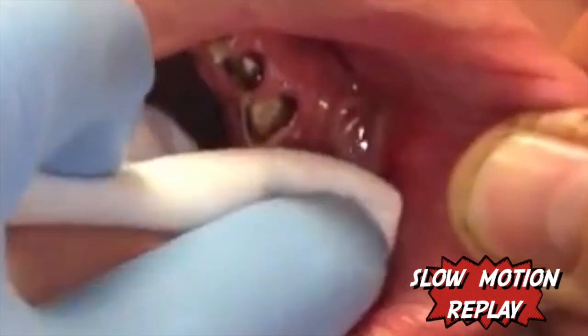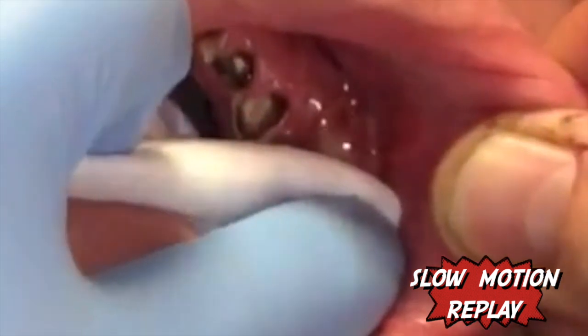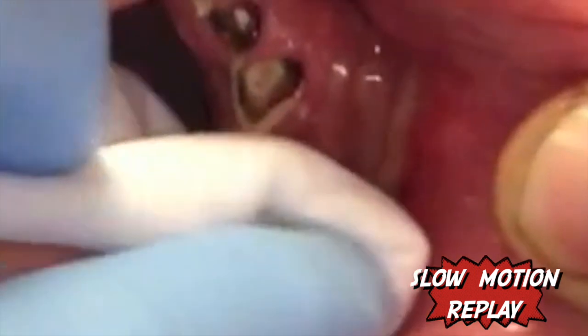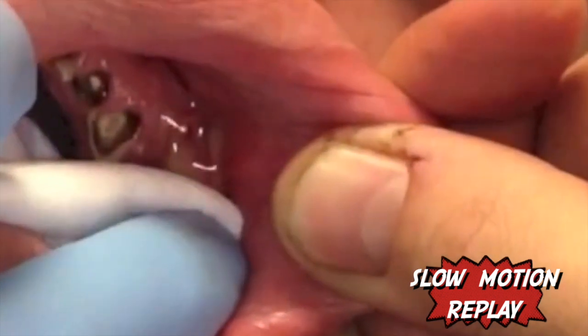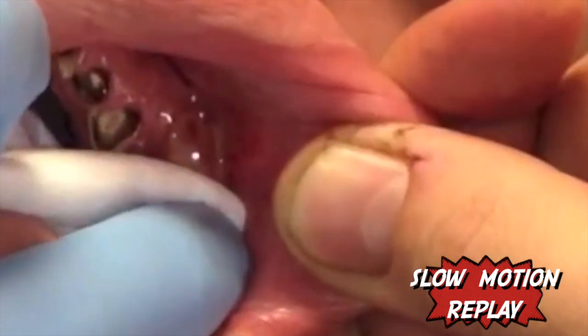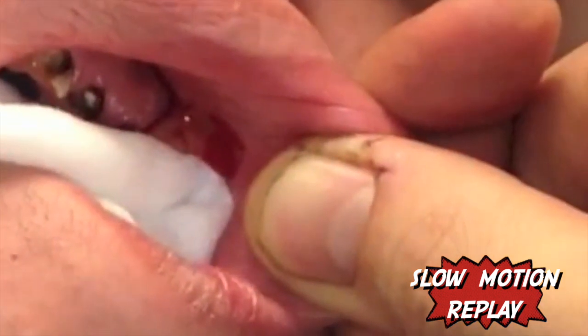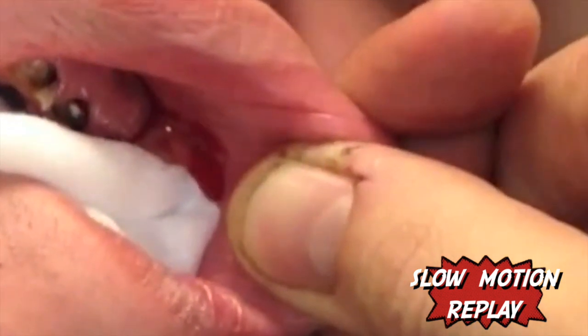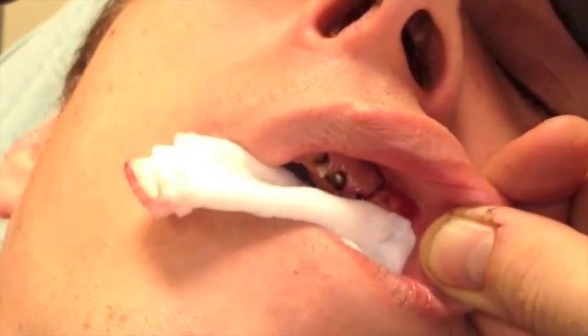Over time I've learned how to do these things better, and usually this would have been better with suction instead of gauze — because then as it opens up the patient doesn't have to taste it and it doesn't go all over his mouth. I can only imagine how bad that must have tasted. So when I do these now, I usually do suction instead of gauze. It helps the patient's comfort and they don't have to taste the pus as it comes out.